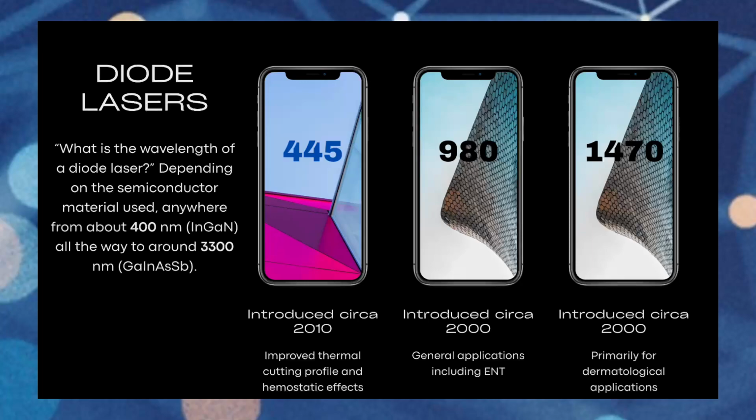So it's completely a commercial factor to maintain the consumables market. But there's no reason that you cannot use these fibers. Whether you can bypass this, you would probably have to work out some kind of electronic system. It probably could be done, but I haven't gotten to that yet.